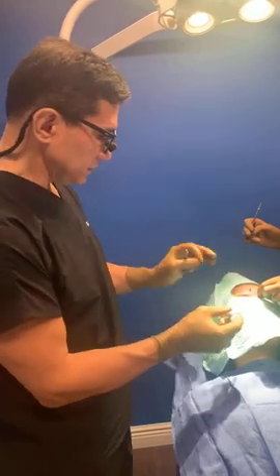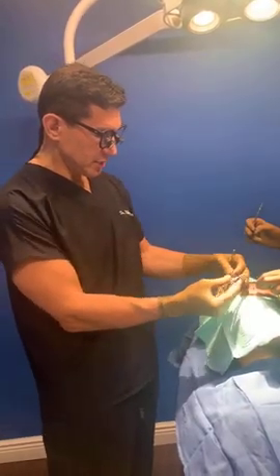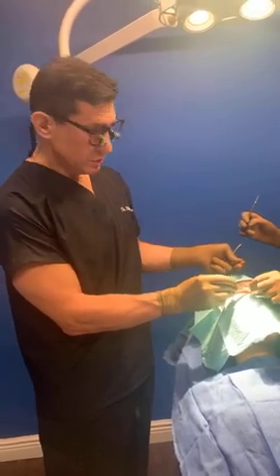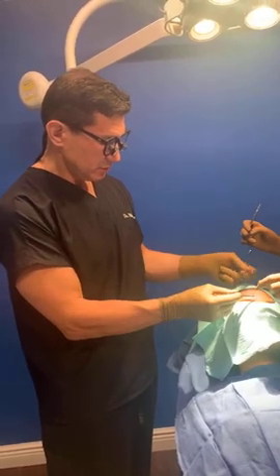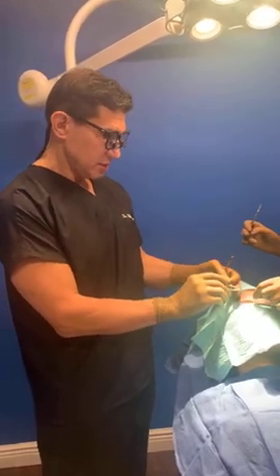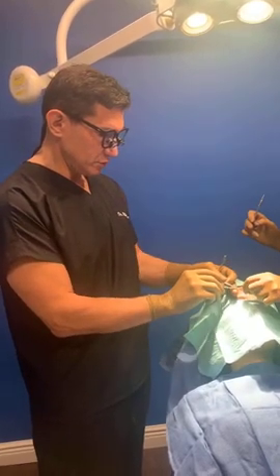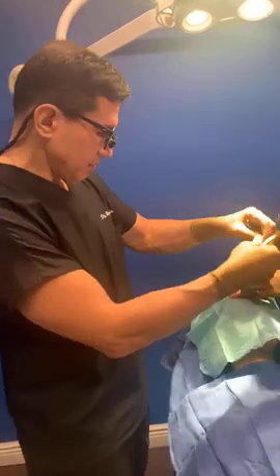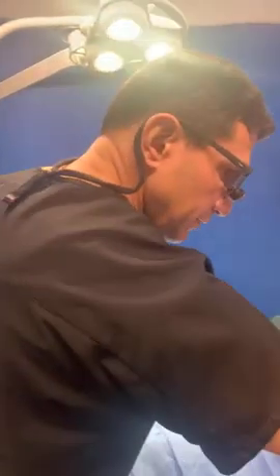I always like to under-promise and over-deliver, so I think that's relevant in this case right now. And this is the last stitch that I'm putting in deep. These are deep sutures that will ultimately just dissolve, but they're able to stay in there for some time so that it keeps the edges opposed to one another. There we go, good.